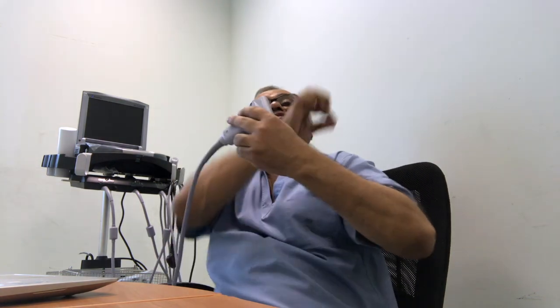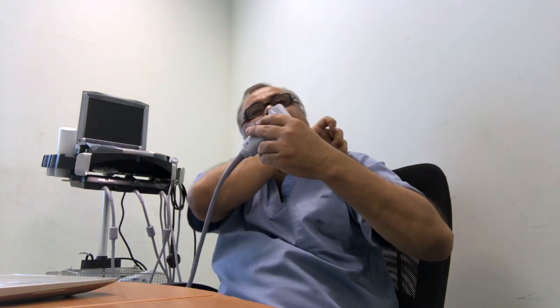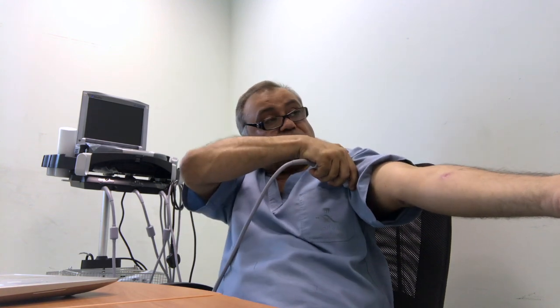There are three benefits. One benefit is your needle is fixed. It's going 6 to 7 centimeters, or 60 to 70 millimeters, inside the muscle, and you are seeing the path where it is going. The needle is stabilized in the muscle. If you penetrate near to the artery, your needle may be moving and there's a big movement. Here your needle has one point, a long path. You are going along the long path to reach the artery. The artery is at this end of your transducer. So you are coming from here.